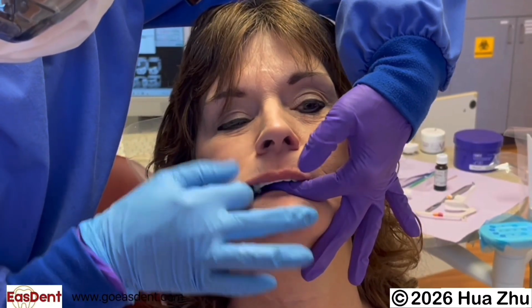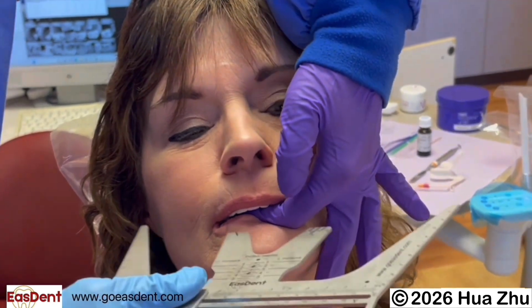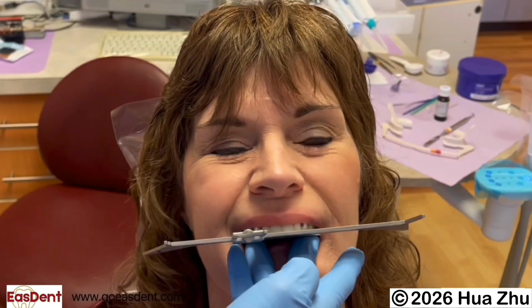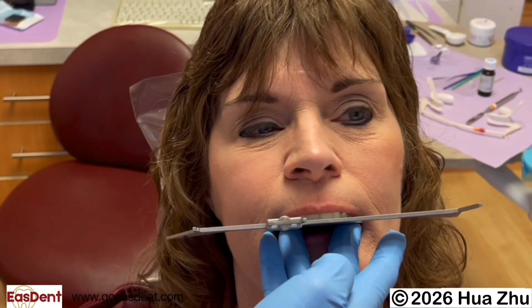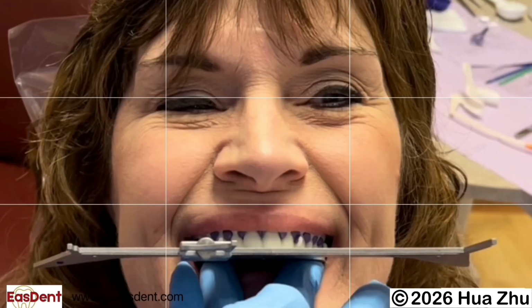Use the Fox plane or Easdent measure to push the Easdent tray in the mouth to align the incisor edge in the vertical direction to give a good aesthetic result with a smile at lip line or a tiny bit hidden in the lip line at rest, and the occlusal plane parallel with the interpupillary line. Extra impression material with border molding and final impression will push the occlusal plane down a little bit later.